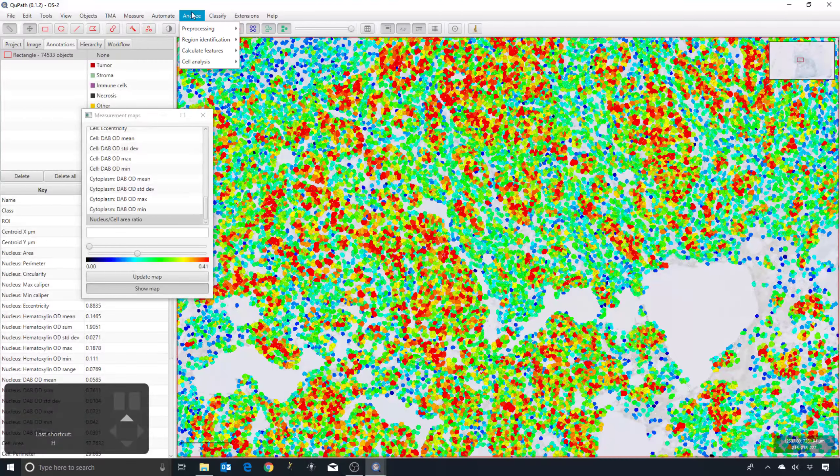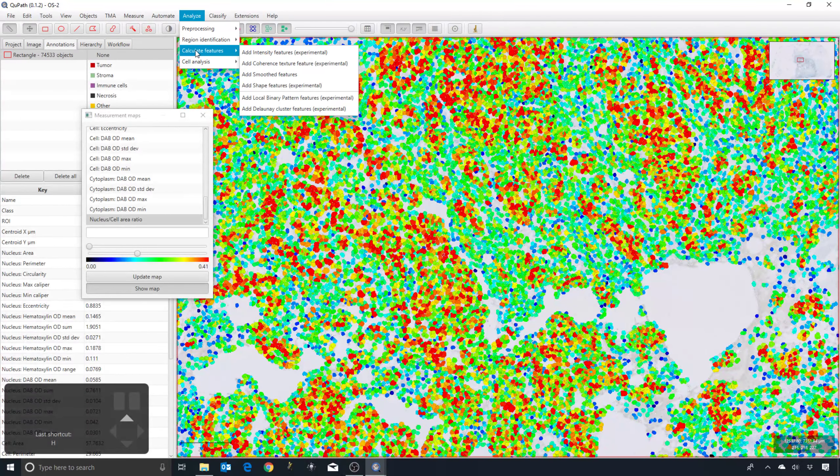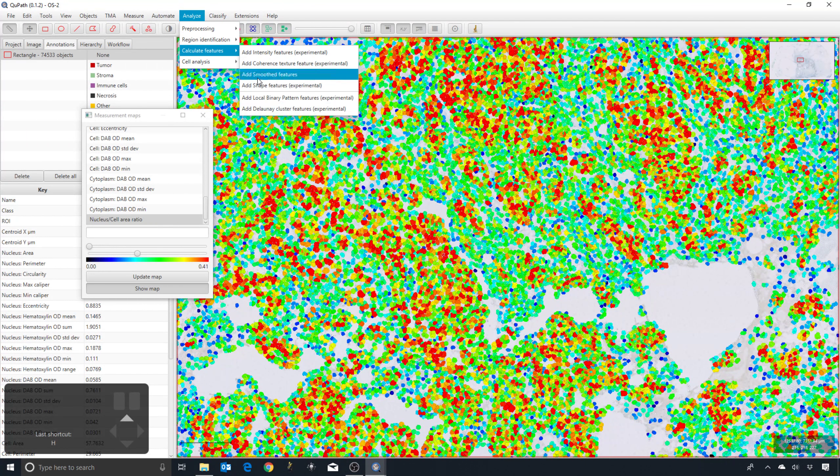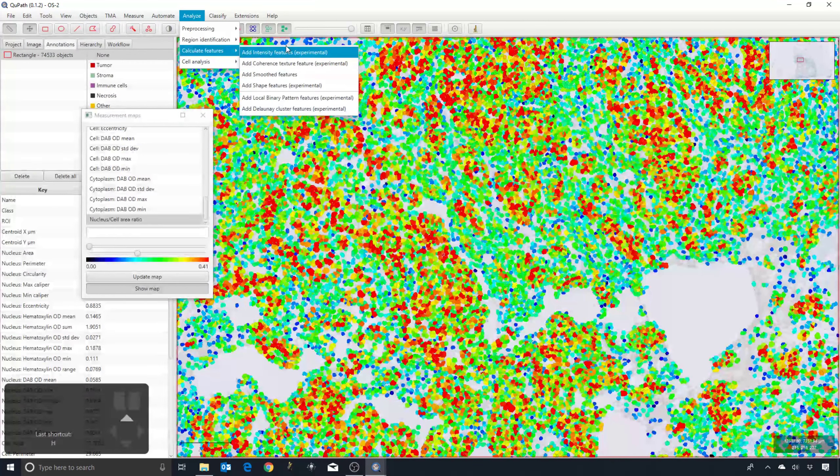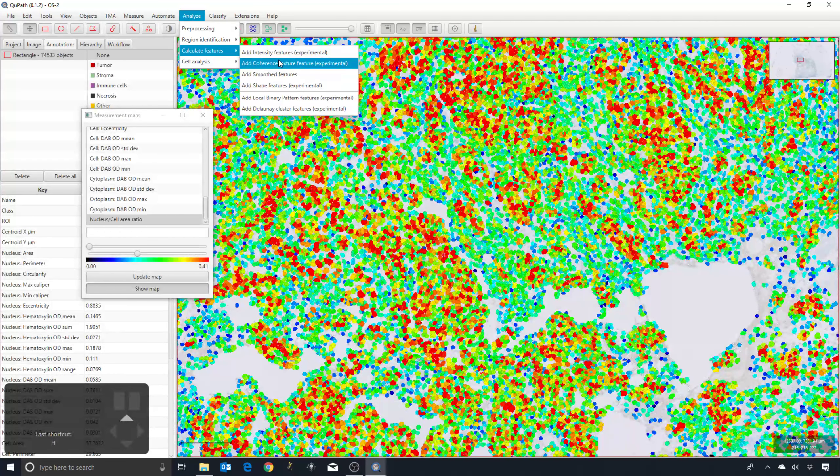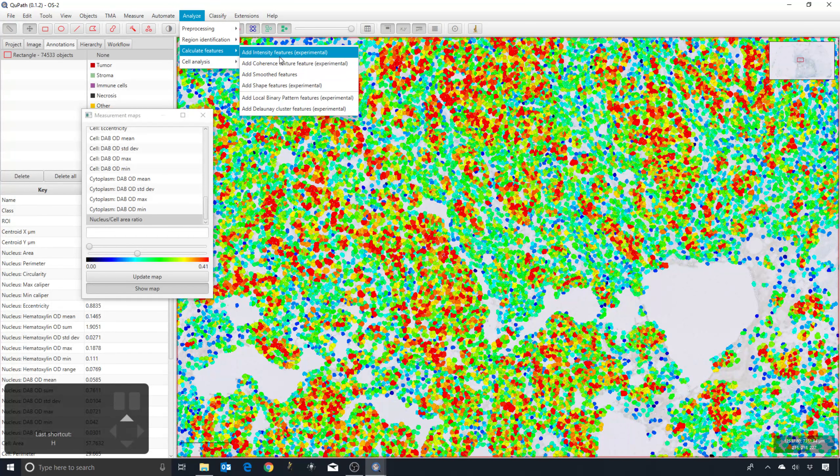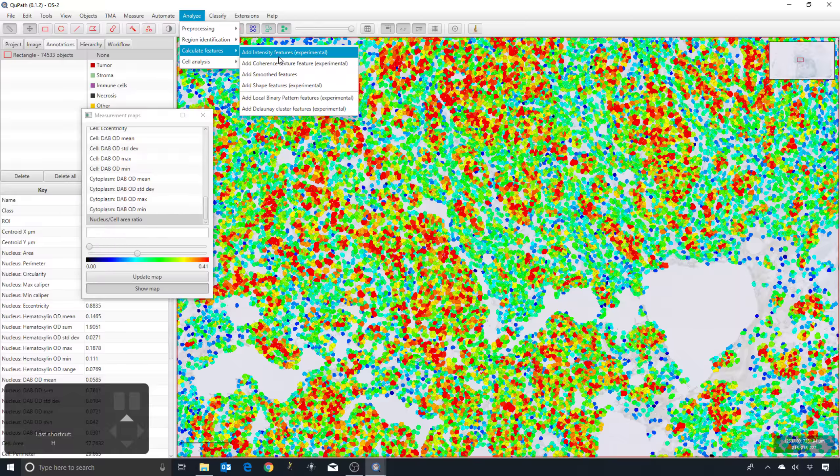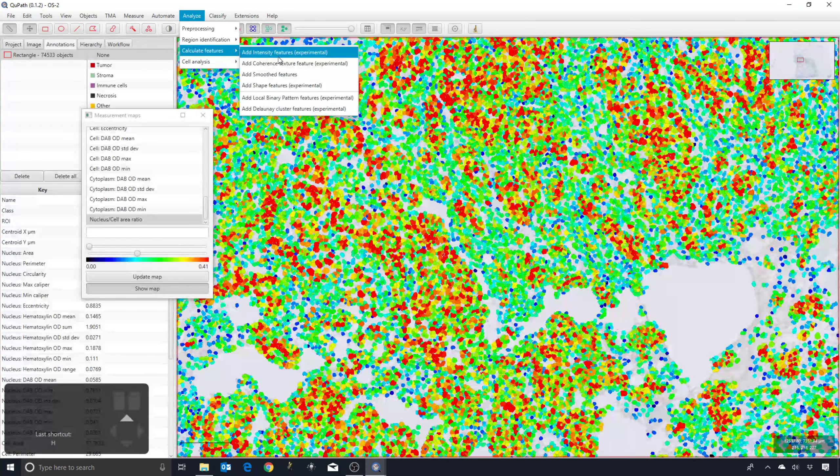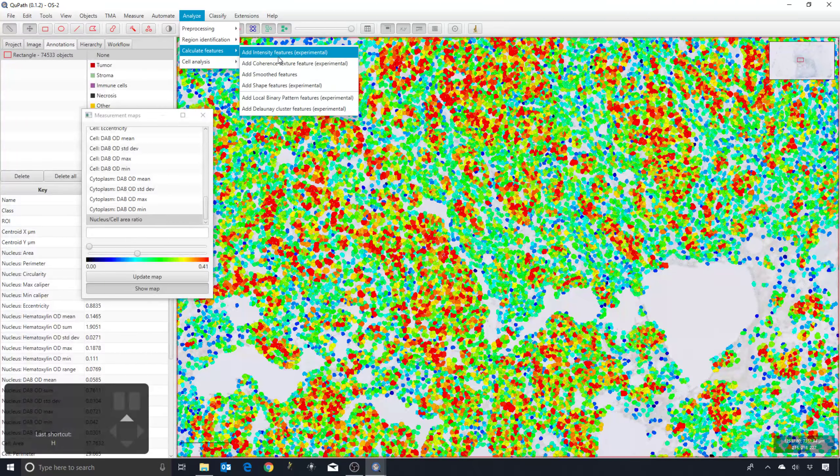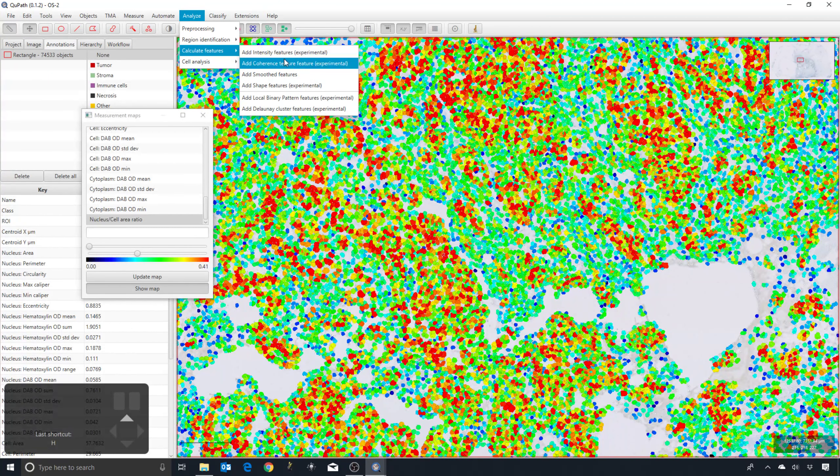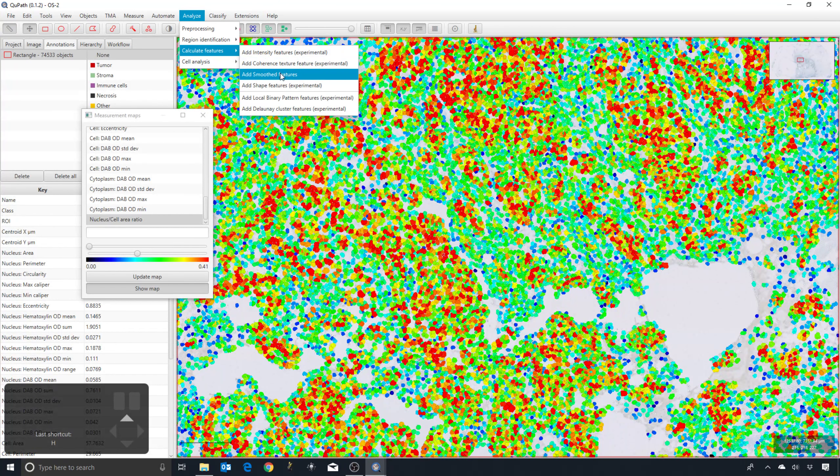A way we can do that is go to Analyze, Calculate Features, and we can calculate new features—new measurements for each cell. There are a few different options looking at textures and so on. They'll pull out each cell, look in an area around the center of the cell, and then calculate textures. They take a bit longer to calculate, but the one I would often do is just add smooth features.